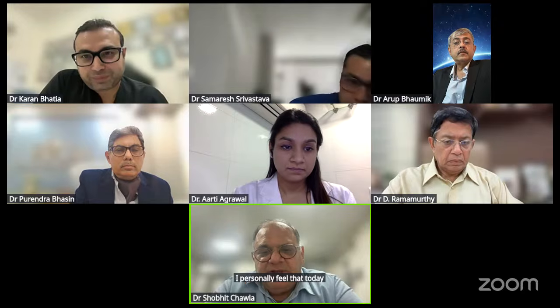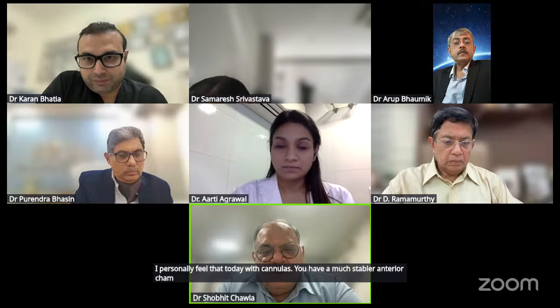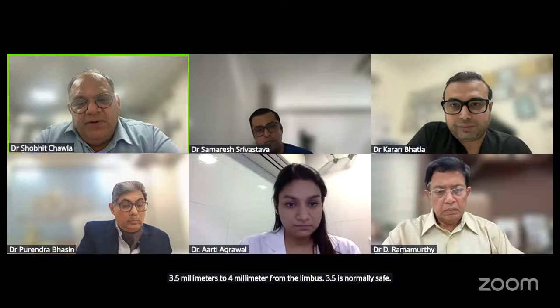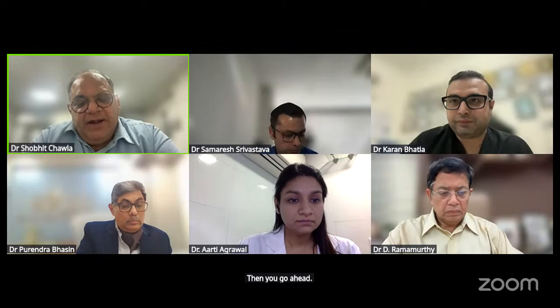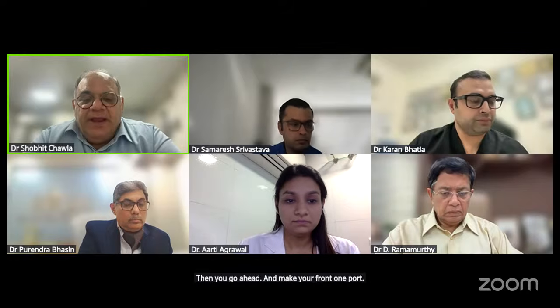I personally feel that today with cannulas, you have a much more stable anterior chamber if you put an infusion 3.5 millimeters to 4 millimeters from the limbus. 3.5 is normally safe. Then you go ahead and make one port in front and one behind.